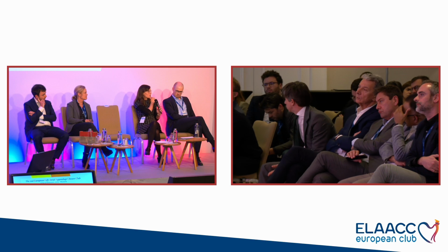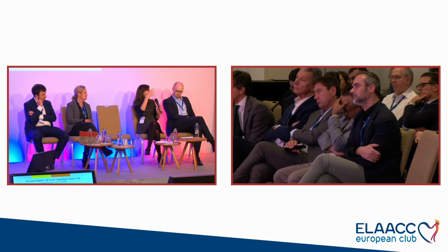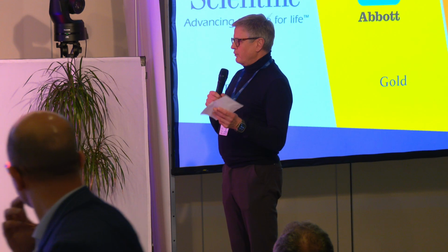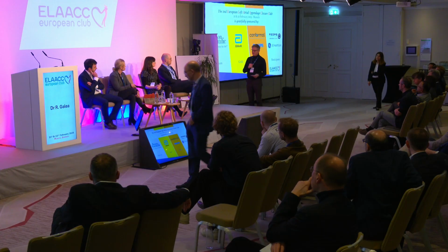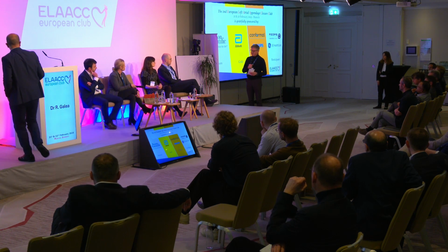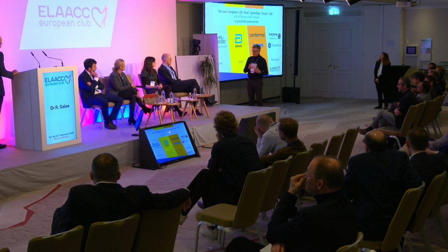And I think that also if we have an extreme angulation of the pulmonary ridge, that we know is related with thrombus, maybe it's worth it to do the second test, especially in patients with chronic AF and large appendages. So there's a lot of good arguments here and a lot of good factors to take into consideration in this timing, and this can be a task for this group to actually come out with some recommendations and some guidance. One more thing.